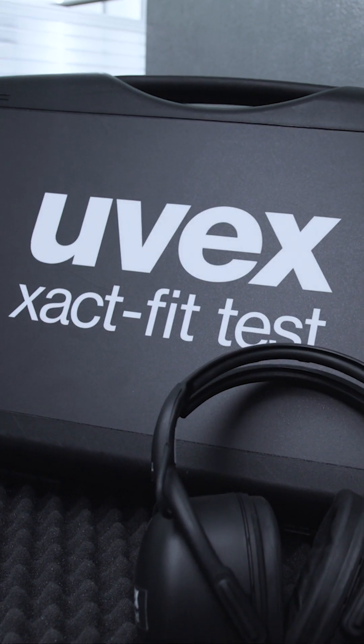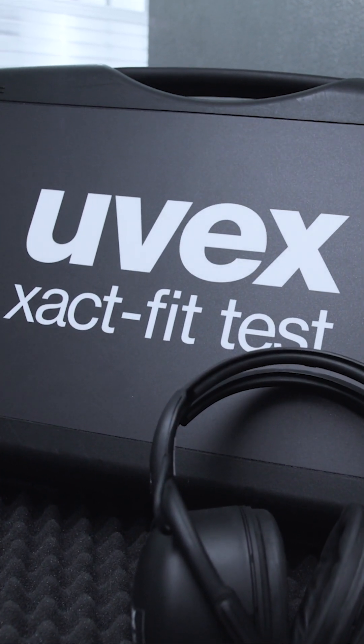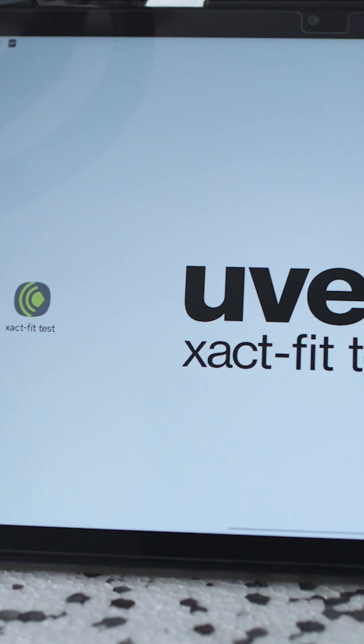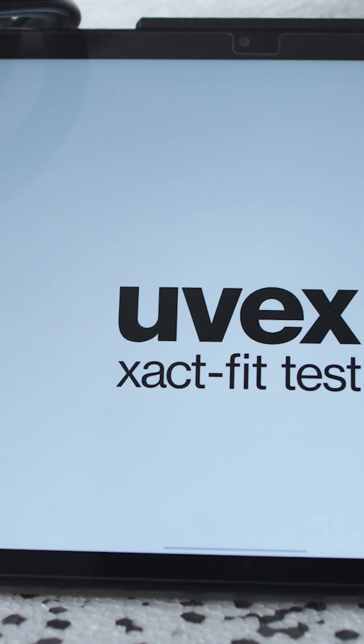We have made the system very flexible and portable. No cables are needed — only a tablet with a wifi or hotspot connection and the earmuffs is needed to perform a test.